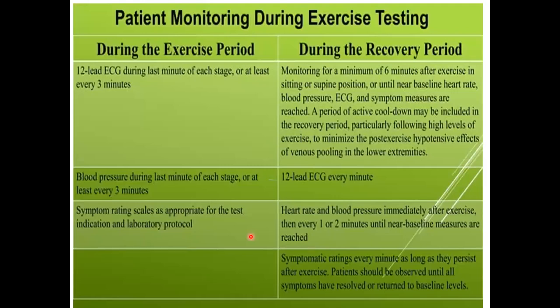So, patient monitoring during this exercise testing is very important, as well as during the recovery period. During the exercise period, a 12-lead ECG should be done during the last minute of each stage, or at least every 3 minutes. Blood pressure should also be measured during the last minute of each stage, or at least every 3 minutes, and symptom rating scales as appropriate for the test indication and laboratory protocol should be carried out during the exercise period. We'll talk about the symptom rating protocol shortly.